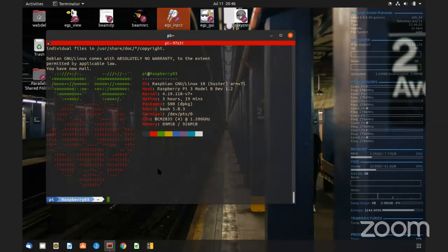It's not simple, but it's doable. When a machine executes and wants to write to the folder, it needs to have access privileges. So the users need to be exactly the same, with the same user IDs, on all machines. You could create users on each machine, or you have on the server what's called NIS.